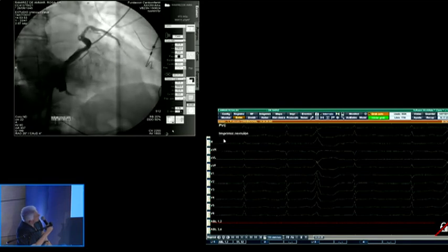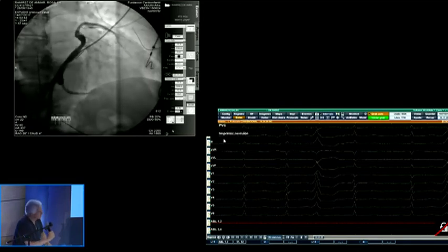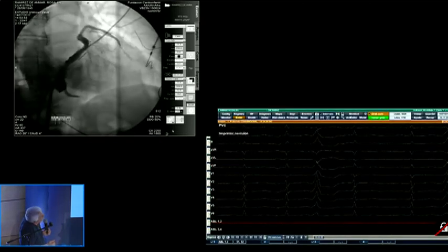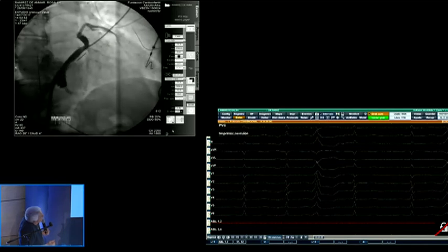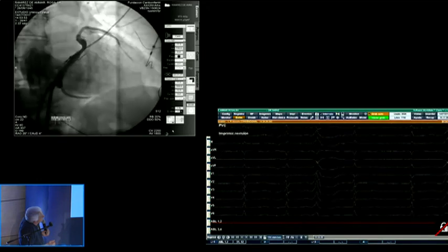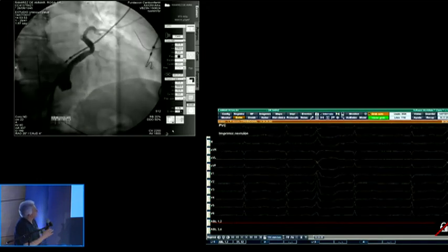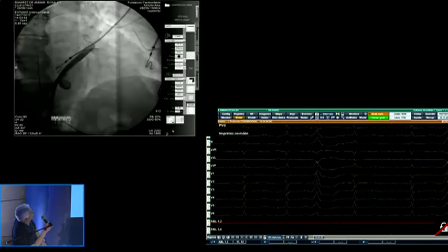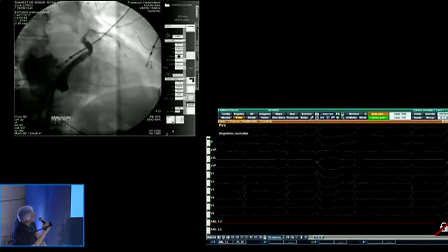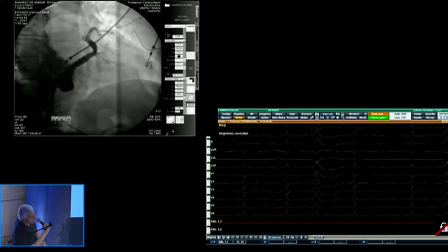Okay? So, lo que quiero enseñar primero. What I want to show first is what we consider manipulation of catheter in the venous circulation. It's very important for this purpose to make a very good venography to start with, because the anatomy may be very variable, and maybe the reason for the accident in 2016 has to do with the anatomy of the patient.